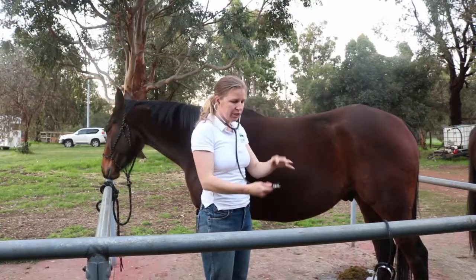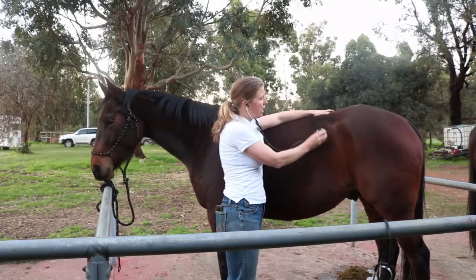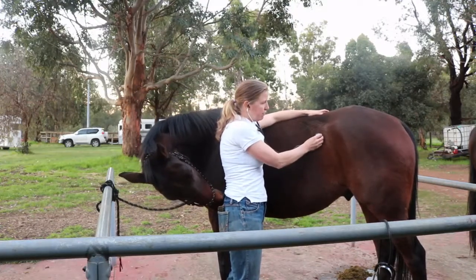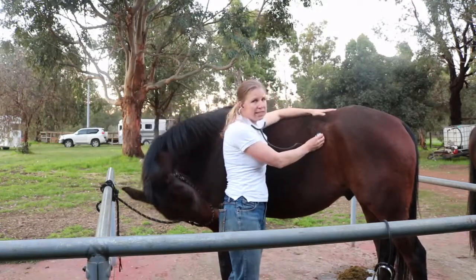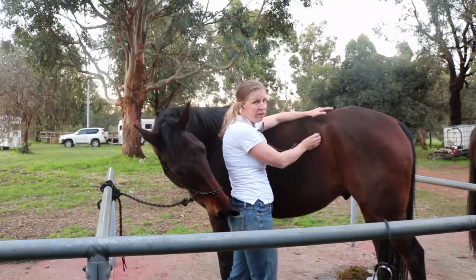I put the stethoscope in and come up to the horse, stroking gently — just like when we check the heart rate — to make sure the horse doesn't get a fright or find a suddenly ticklish spot. I place the stethoscope in that nice soft area and listen for a good 30 to 60 seconds in each quadrant to make sure we're hearing all the gut sounds.